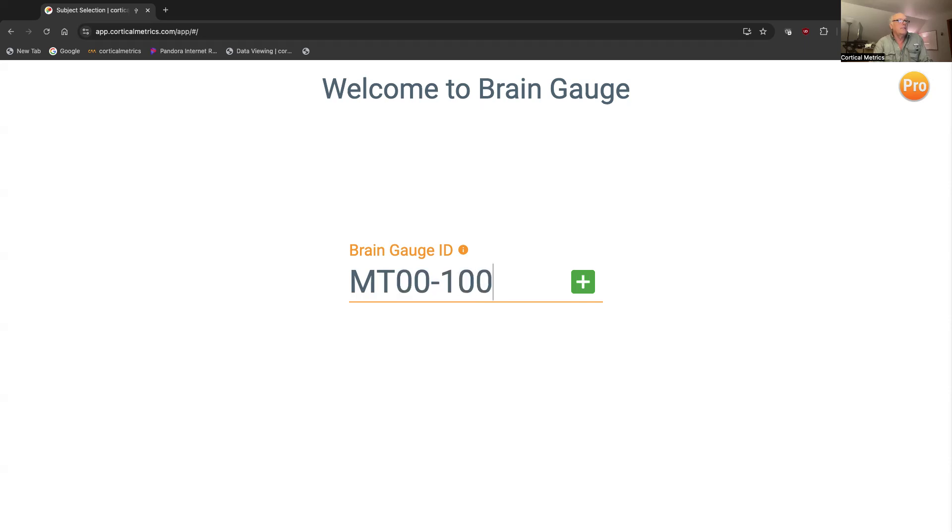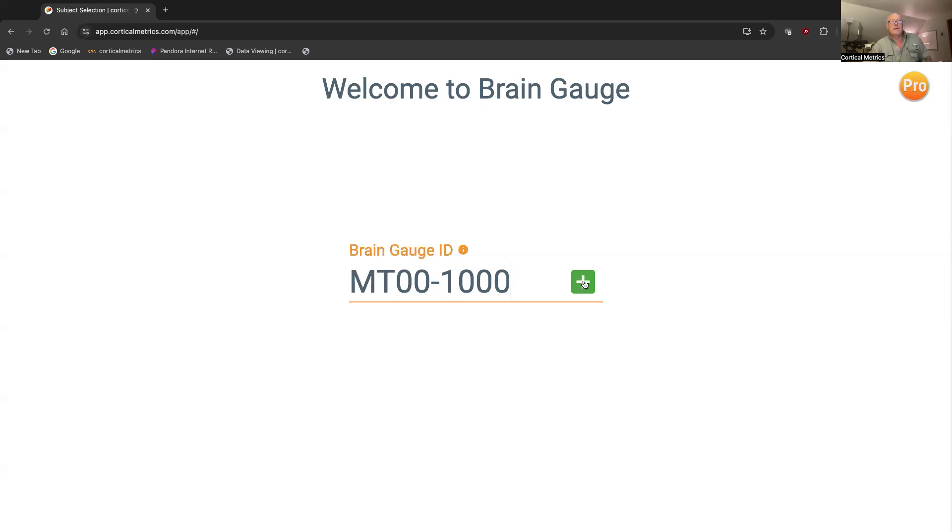Maybe I'll say the subject ID is MT001000. It can be anything you want, but this just identifies a person testing.